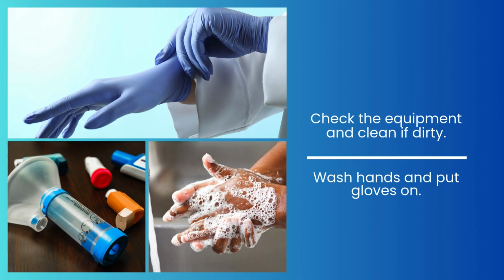It's almost time to administer this medication, but first we need to check the equipment and clean it if it is dirty. We'll need to wash our hands and put clean gloves on. Once you have finished washing your hands, we'll go identify our resident.